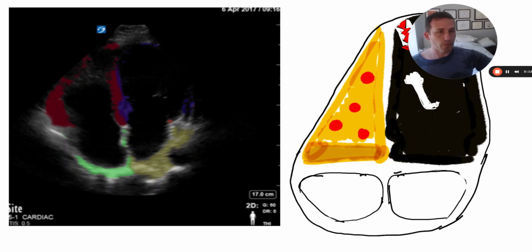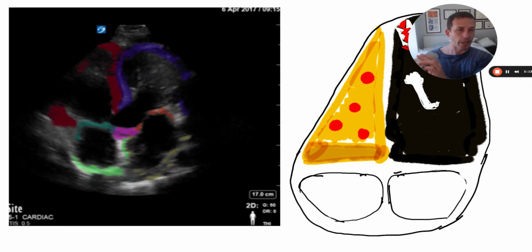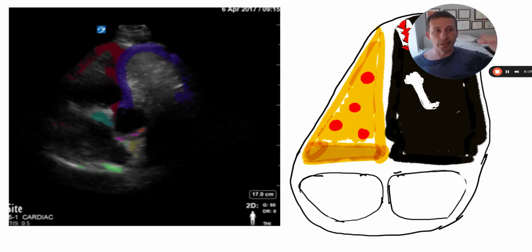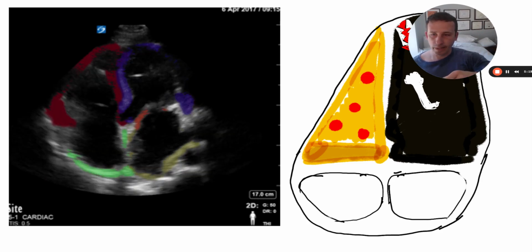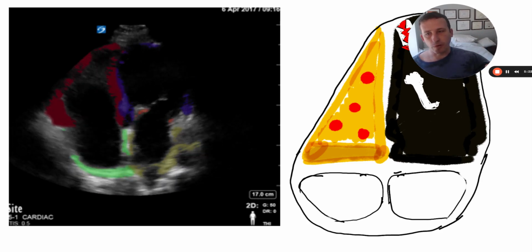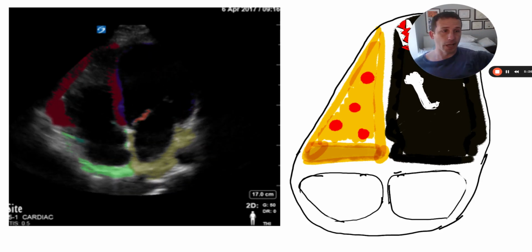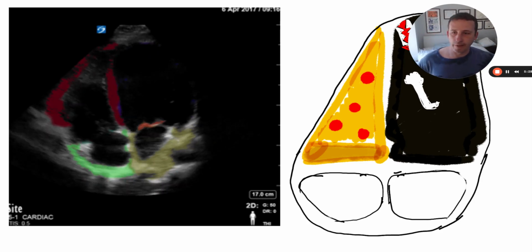Sometimes if you fan forward, right, so you keep fanning this way, you're going to look at the anterior surface of the heart and you're going to see the aorta also. So that right there, you can see the aorta. That's called an apical 5-chamber. So when you've got both atria, both ventricles, and that LV outflow with the aortic valve, that's a 5-chamber view.